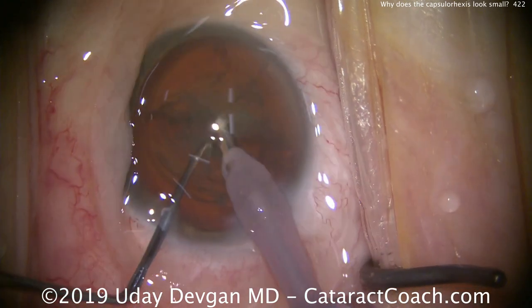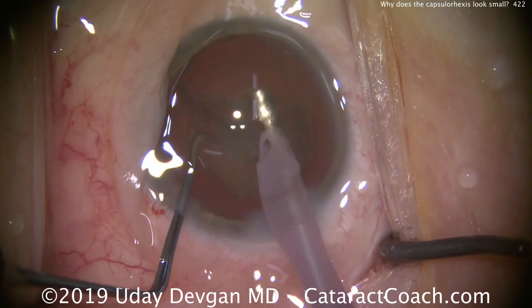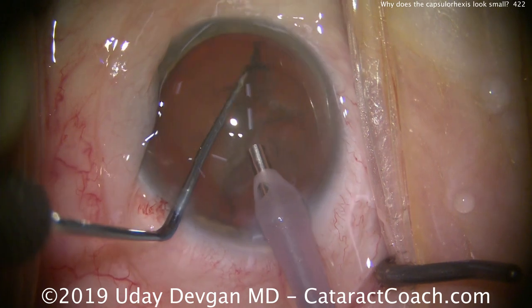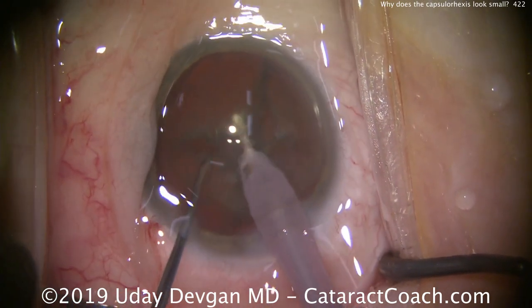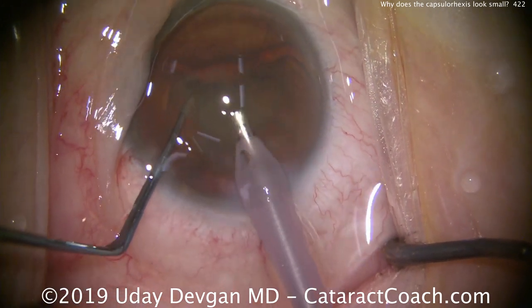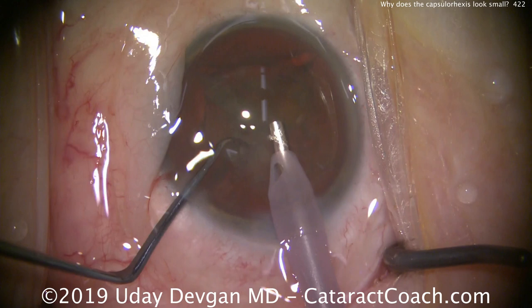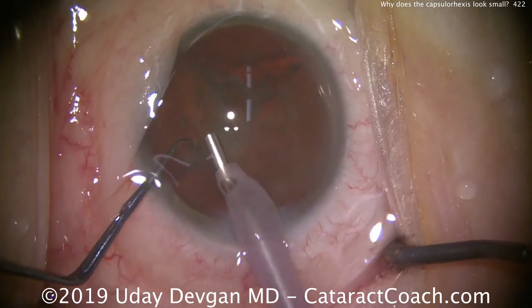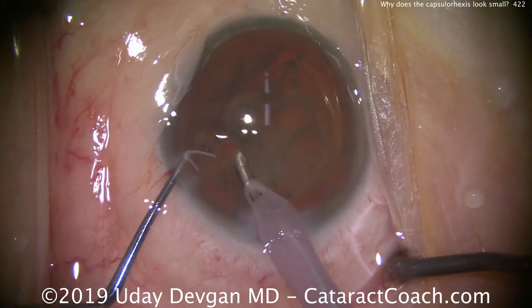First we'll chop it there — we've got two halves separated. I'll try to bring out a half but it just doesn't want to come, because the nucleus has such a large diameter. So let's chop a quarter off. There we go. We can bring the quarter out of the capsular bag. One quadrant is up here — we'll take that one out, then the next quadrant. We can keep sub-chopping and bringing pieces out of the capsular bag.